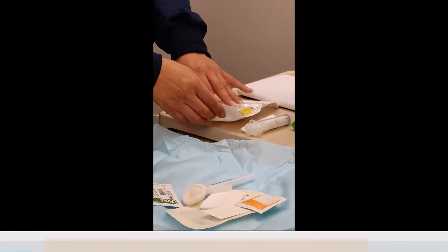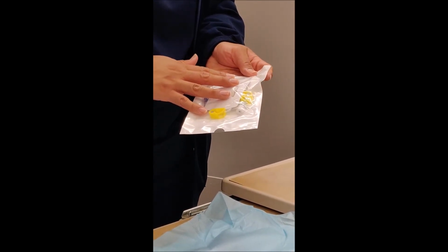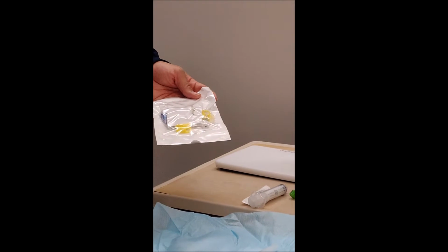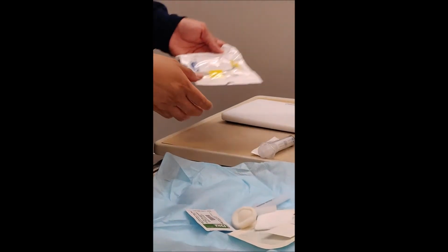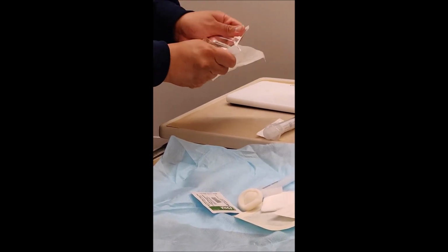Okay, so the first thing is, we're going to prepare our needle. We're going to make sure that it's primed, capped, ready to go, so that once you access, you'll have your saline attached to it, and you'll be able to draw the blood for whatever you may need. So we'll open the kit.